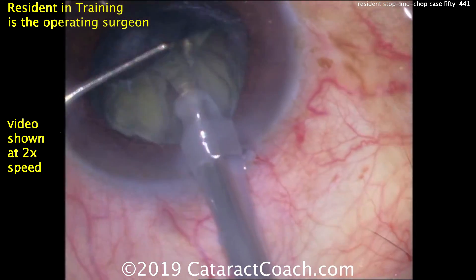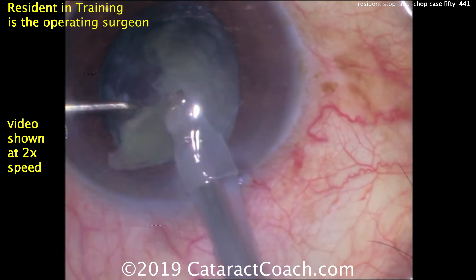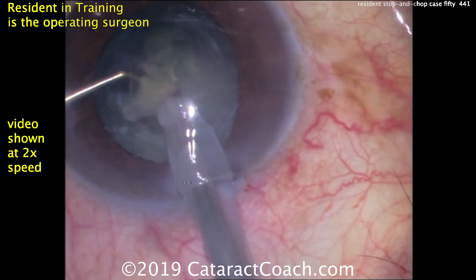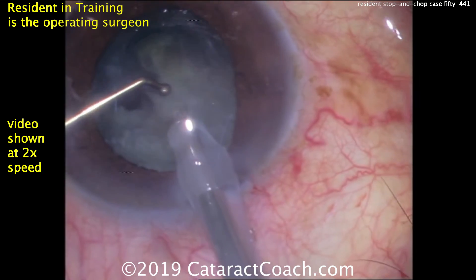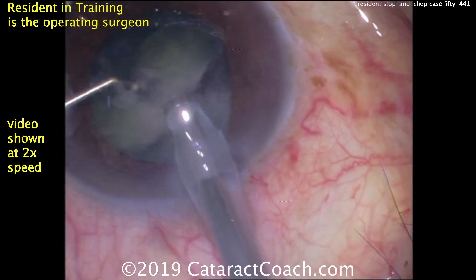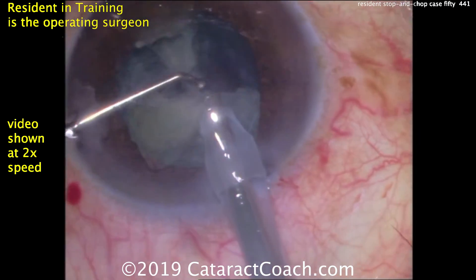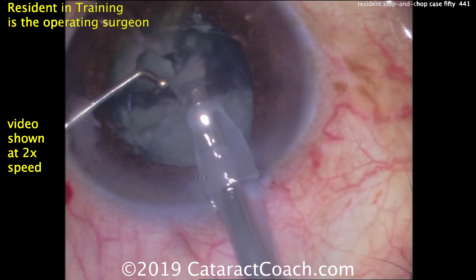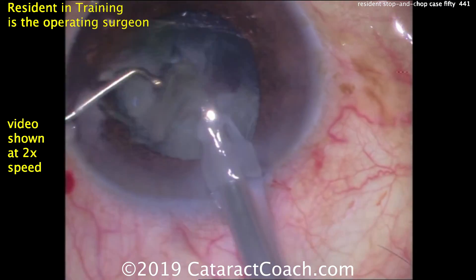Again, this is two times normal speed, so if the movement looks a little choppy it's because we've sped up the video. That first small quadrant is being brought towards the phaco tip — good use of the second hand to achieve that. Now the remainder of the quadrant from the first chop, and then each of these little sextants is now subdivided and phaco-emulsified. That looks great.